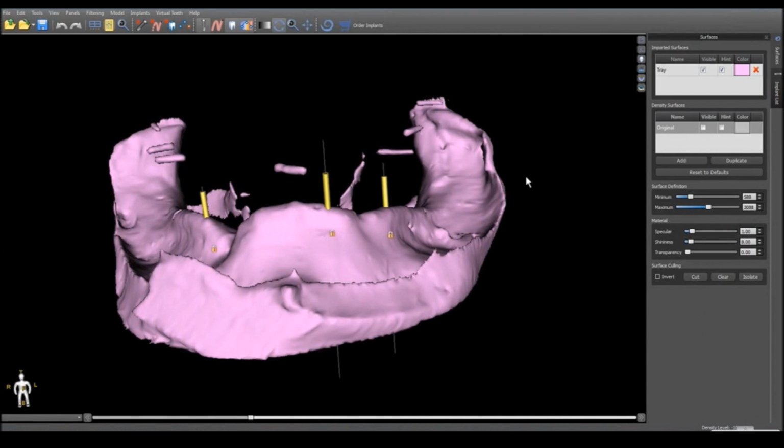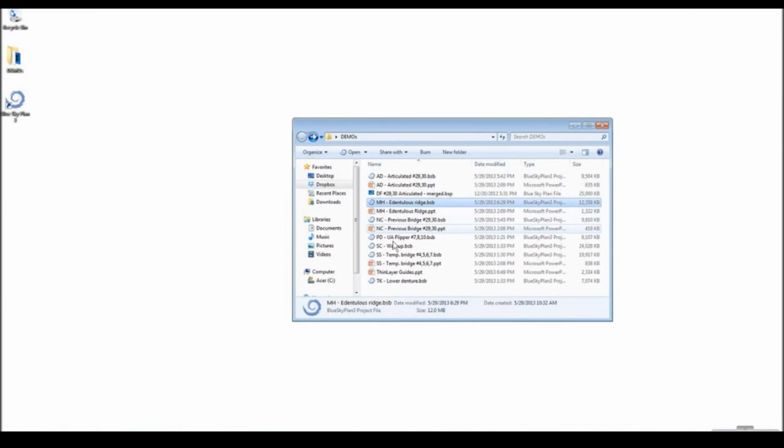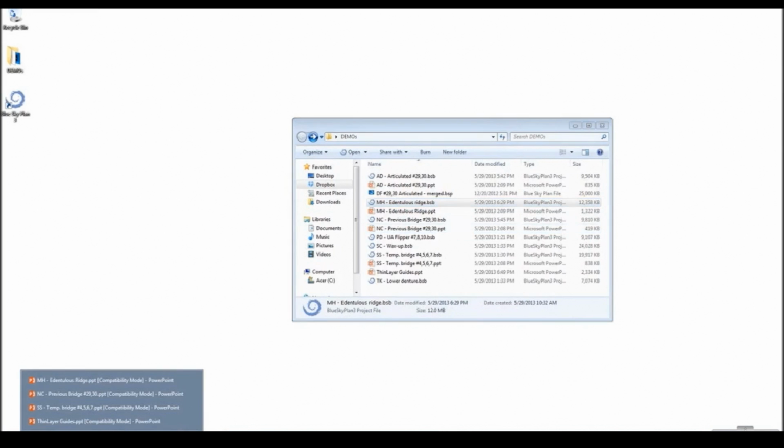So by being able to visualize the soft tissue outline at the same time that you see the bone outline, obviously is the necessary data in order to plan these cases correctly. I have some surgical slides on that case as well.